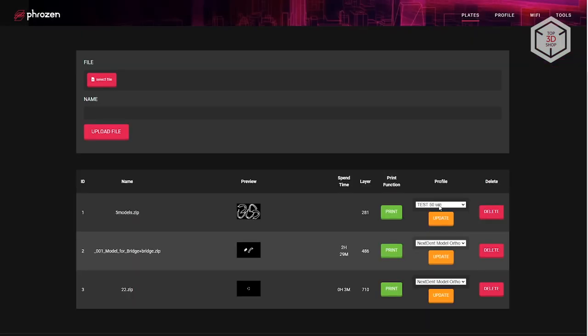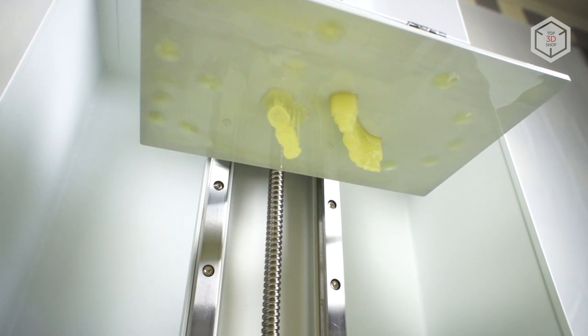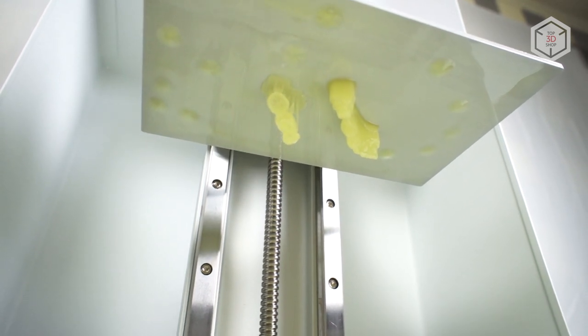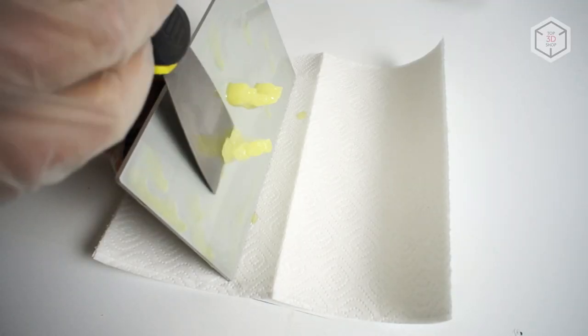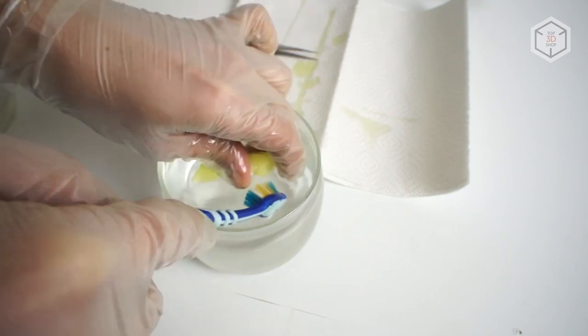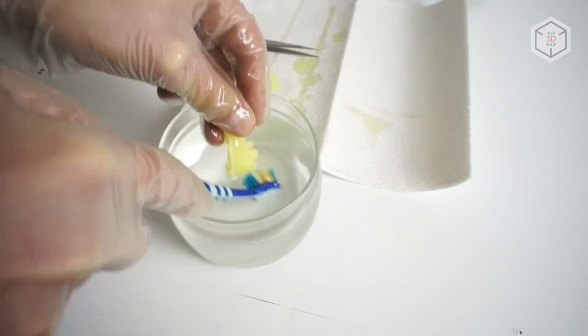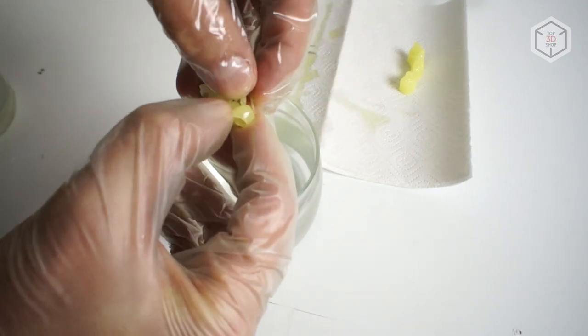After that, select the resin profile for the job, click the Update button, and the print session will start directly through the web interface. Since we set a slow Z-axis speed complying with NextDent's recommendations, the whole print took almost 2.5 hours. It's possible to print faster, but the risk of damaged parts would be proportionally higher. The model with teeth was printed directly on the build plate, while the bridge was suspended on supports for the mounts to be positioned above for best surface quality.